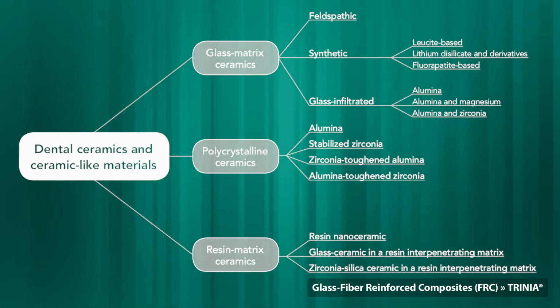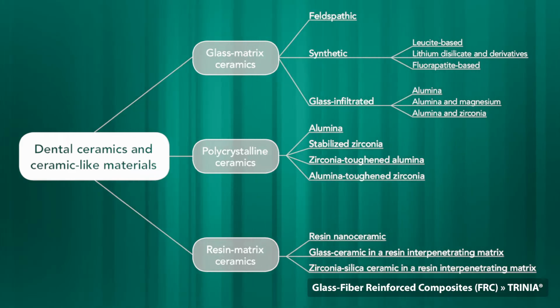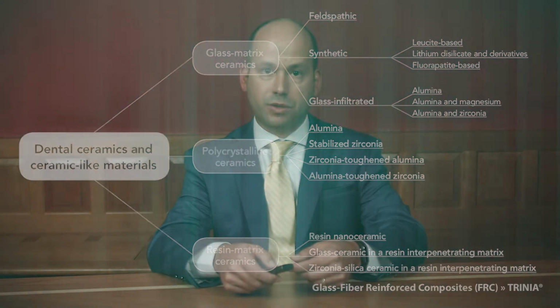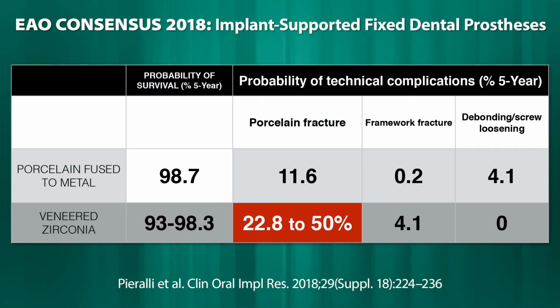So although in this classification proposal manuscript, you may find the majority of all-ceramic materials' description and indications according to the manufacturer's instructions, the clinical performance of all-ceramic materials, especially for large span implant-supported reconstructions, is still a matter of concern. When we look at the systematic reviews from the latest European Academy for Osseointegration consensus in 2018, it becomes evident that there are still major challenges for improvement of porcelain fused to zirconia for it to become the standard of care.